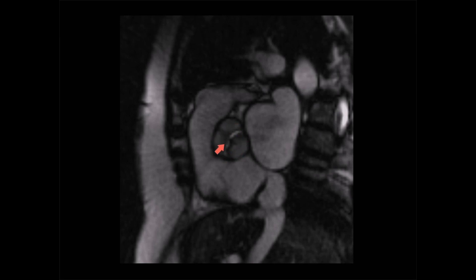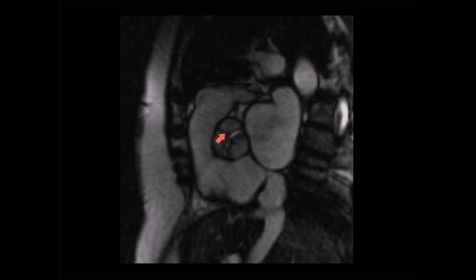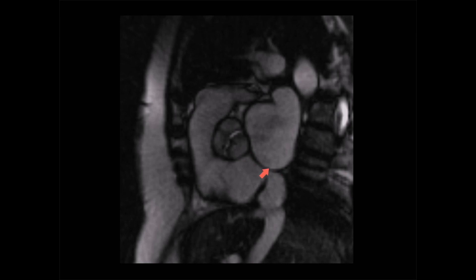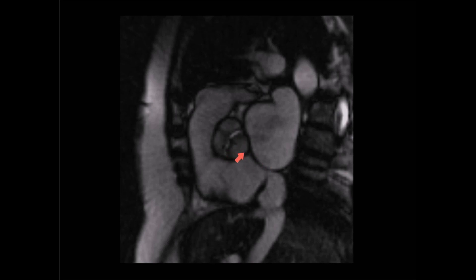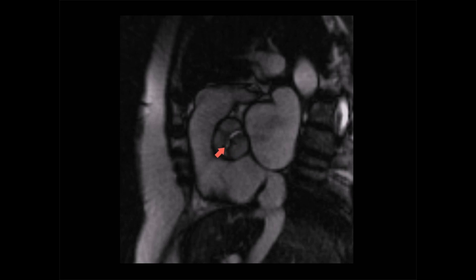Then we have the short axis view of the aortic valve, where we see it en face. This still frame shows a pseudo-bicuspid aortic valve — two fused cusps joined by a median raffae, and then a separate cusp. To identify the cusps we can either look for the origins of the coronary arteries, or use the interatrial septum, which is adjacent to the non-coronary cusp. That makes the remaining cusps the right coronary cusp towards the patient's right and the left coronary cusp towards the patient's left.